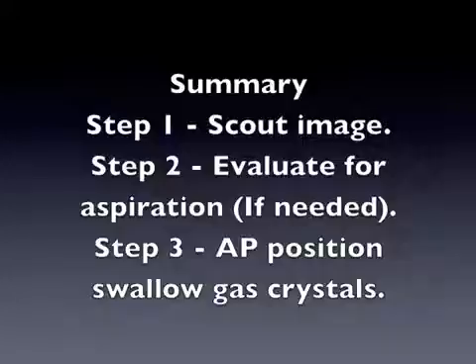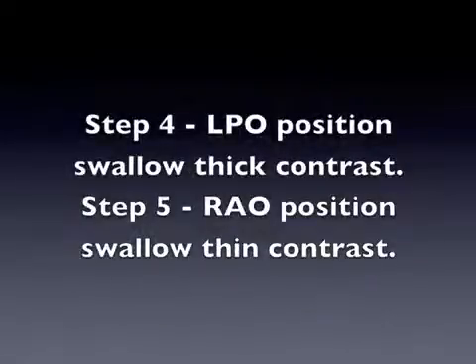This is a summary of a basic esophagram. Step 1, scout image. Step 2, evaluate for aspiration if needed. Step 3, AP position, swallow gas crystals. Step 4, LPO position, swallow thick contrast.